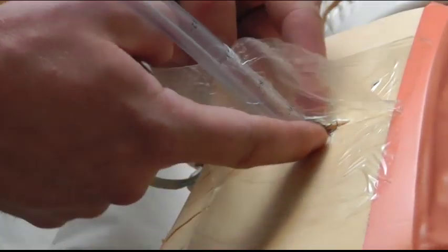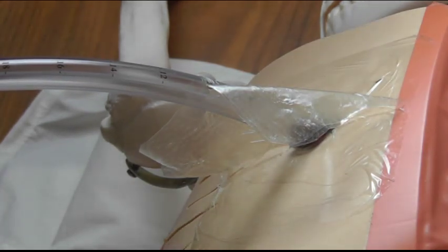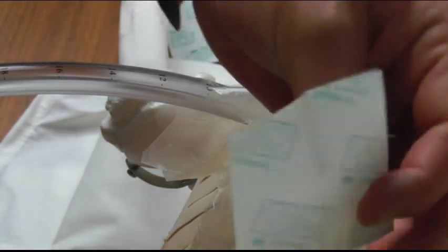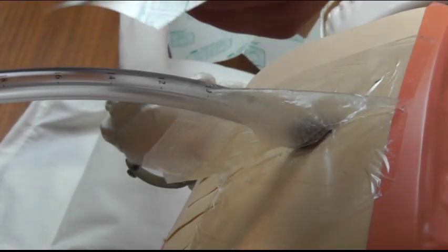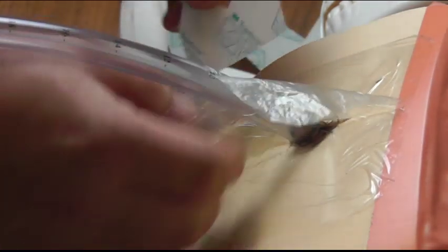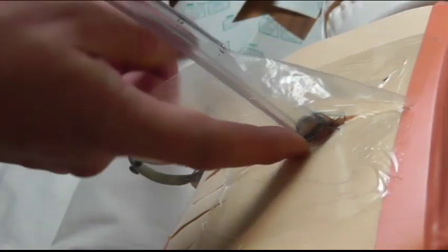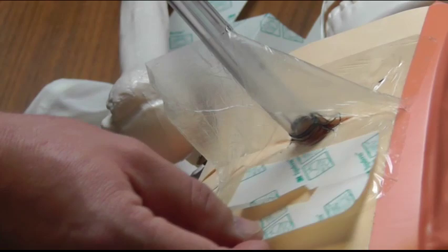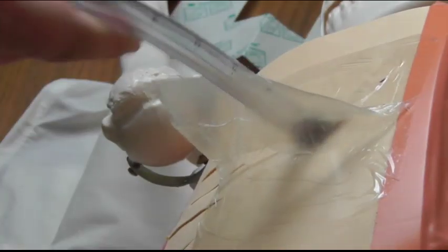Some hospitals will actually get you to cut a square of what they call melaline or gauze and if you have some dressing material like that before you put your sandwich dressing on, what you can do is actually get a five centimeter pad of some sort of absorbent pad cut into the middle. Cut a bit of a gap out and actually slot that in around your tube before you put your sandwich dressing on. So just a bit of extra padding there and it stops anything coming in and out. I just didn't do it for the purpose of the demonstration because I think it's good to be able to see the tube coming in and out. You don't have to put any gauze or dressing in there. If it's too big, you can see it'll stick out the edges and actually lift your dressing off. So it can be a bit fidgety but some people recommend doing that because that will sit nicely around your tube and absorb any small amount of the blood that comes out.